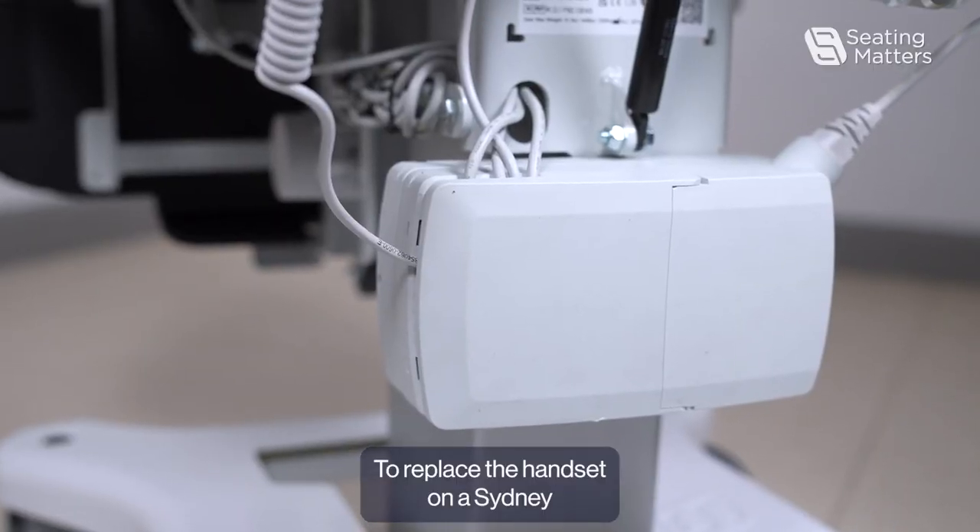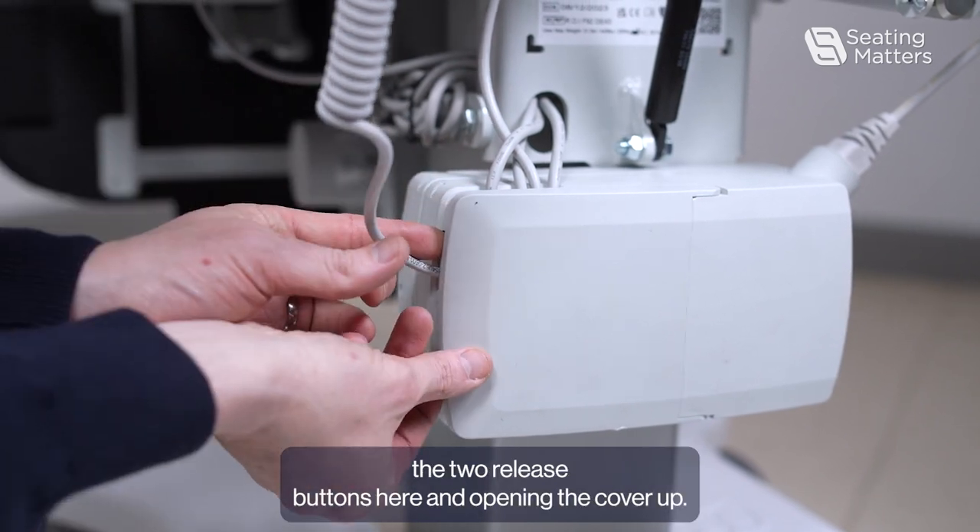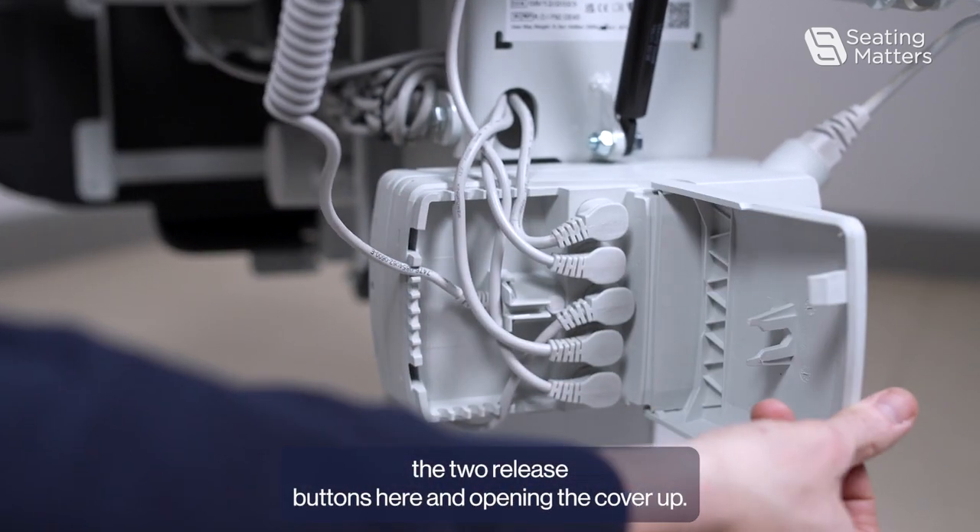To replace the handset on a Sydney, first we need to gain access to the control box by just pushing the two release buttons here and opening the cover up.